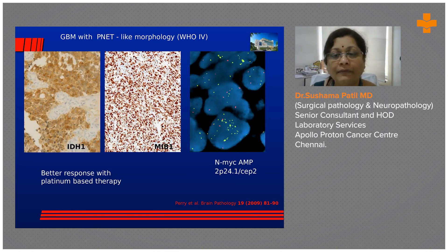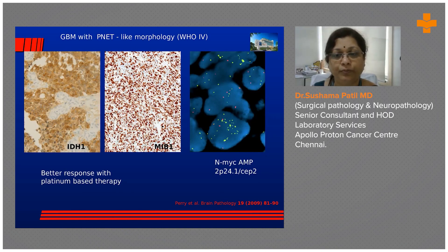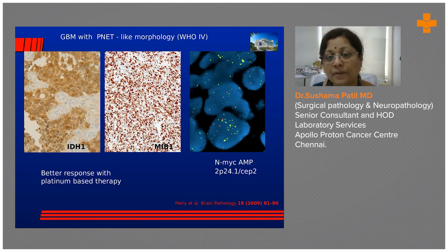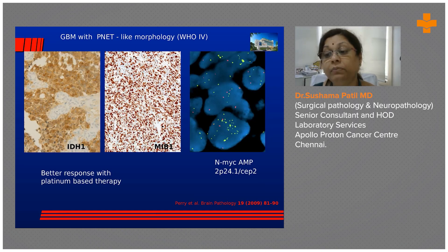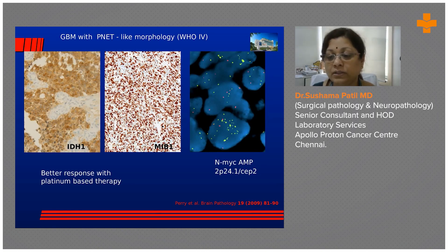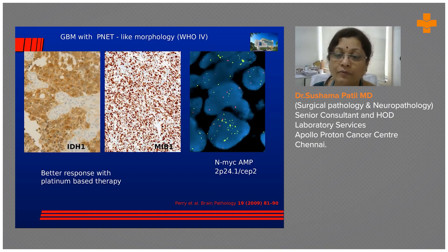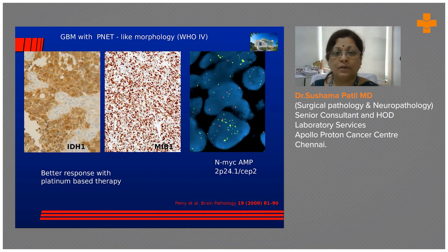These tumors have a very high mitotic index. In this particular case, IDH1 was positive in the glial component, and the tumor had accrued a secondary NMYC amplification. A subset of them show NMYC amplification — the yellow represents amplified signal, and the red dots are the CEP reference probes for chromosome 2. That is how we perform and analyze the FISH test for this type of glioblastoma.